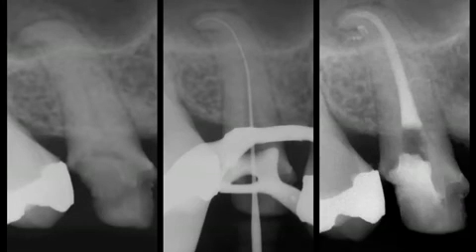I have found that endodontic performance improves dramatically when we use the strategy, start with the end in mind. This means try to visualize the post-treatment result on the pre-treatment film. If we're going to carry out this concept, then we need a treatment plan, a mechanical strategy, and we should be utilizing the best and most proven instruments available in the marketplace today.